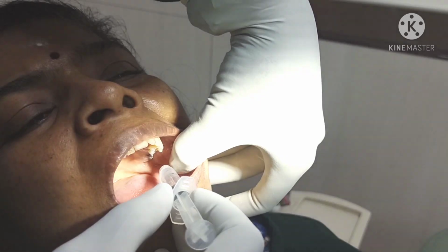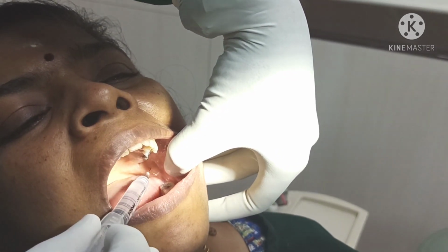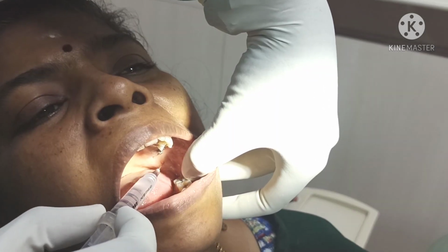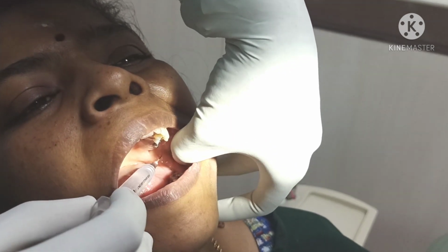Don't go deeper. Now you can inject, or come to this side, or you can go deeper. Okay, now aspirate. This is the important part. Now you can inject. Okay, now you inject fully.